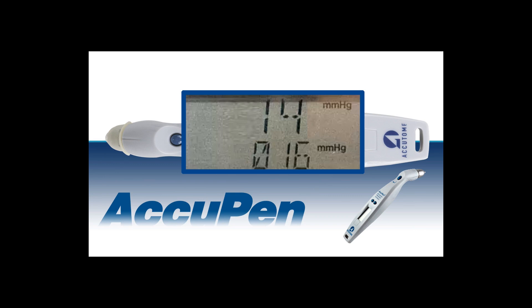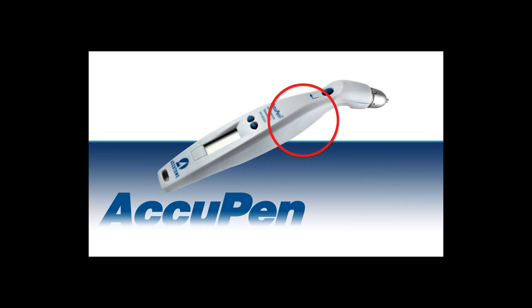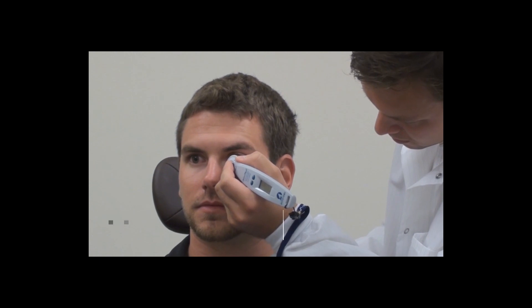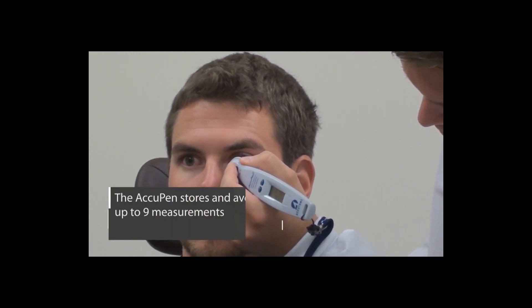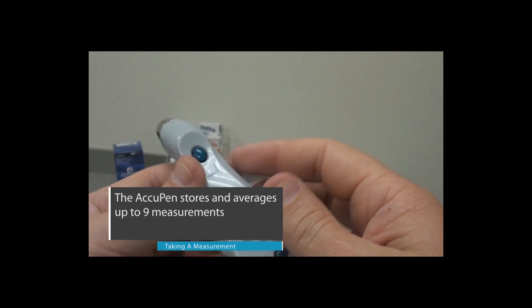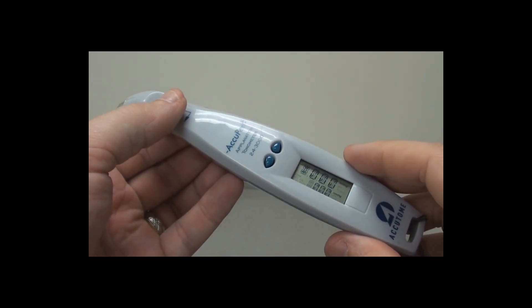To obtain a second IOP measurement, position the pen into testing position. Press and release the action button and tap the cornea again. You can record up to nine separate IOP readings and can view the independent readings by using the arrow buttons next to the LCD screen to scroll through the measurements.